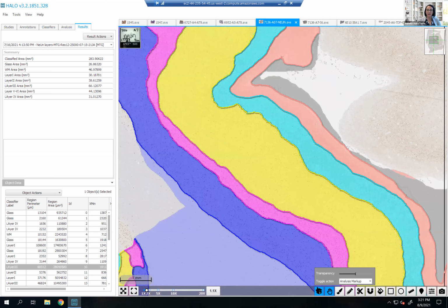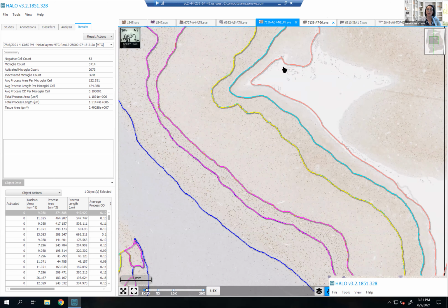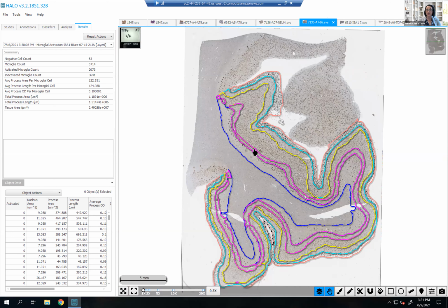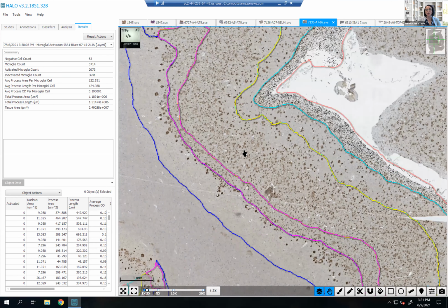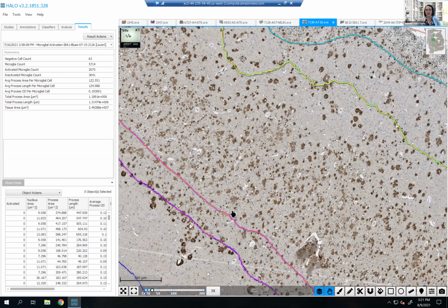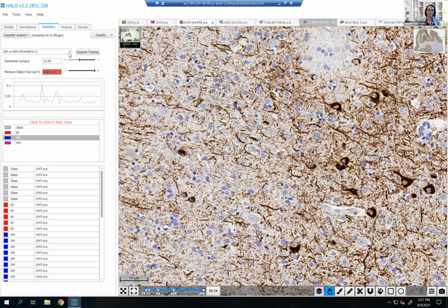So you can obtain the different layers of the cortex, and you can replicate those data by synchronization using the serial annotations to get that classification, and the same aspect, for example, in this case, to analyze the different plaques present in the different layers of the cortex. Another very useful classifier here is the nuclear segmentation.